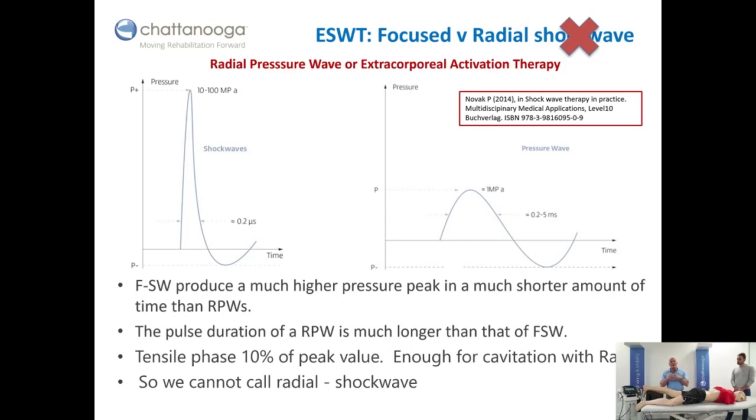Hence why we now refer to this as radial pressure wave therapy. Now some authors have described this as extracorporeal activation therapy because they want to further distance this from focused shockwave, true shockwave. Okay? So for the rest of this lecture, I want you to start using this terminology of radial pressure wave because this is what you're now going to see in the literature.